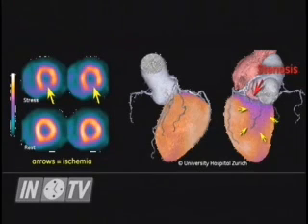It's not clear enough to show the actual blockage, because this, once again, is that volume rendered pretty view, but not the nuts and bolts that we like to look at at higher magnification. But it does fuse the two. All right, next slide, please.